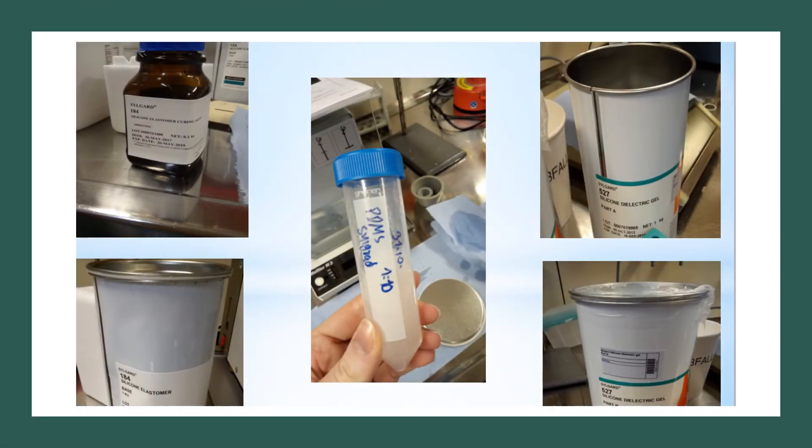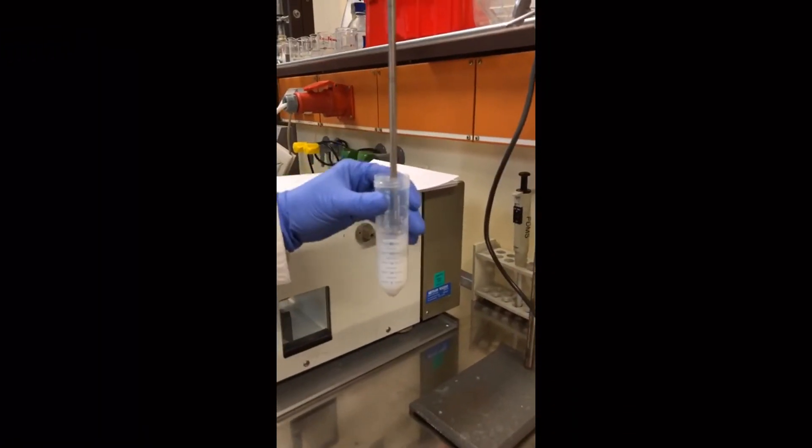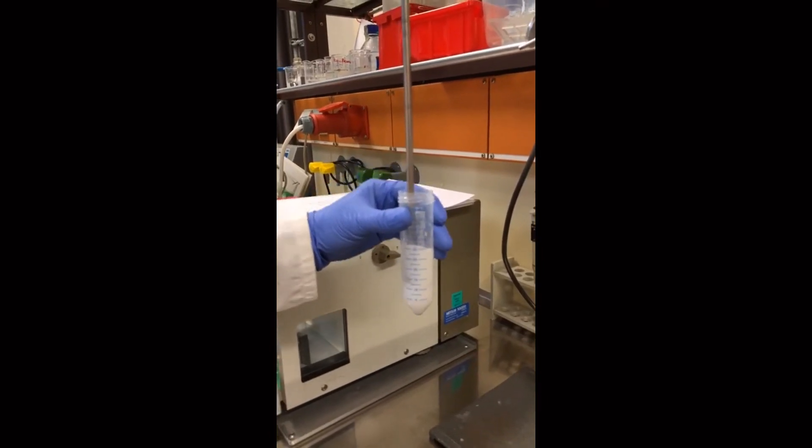After preparing the components together — the right elastomer and the curing agent — the gels were mixed well, poured into petri dishes, and heated for two hours.